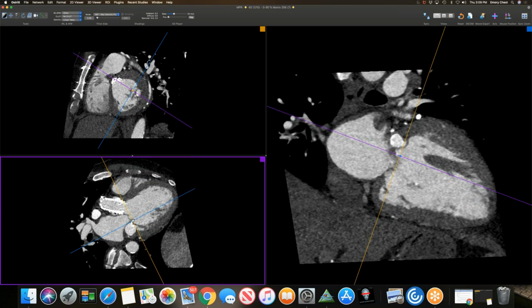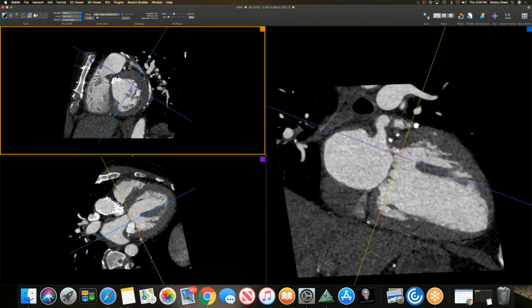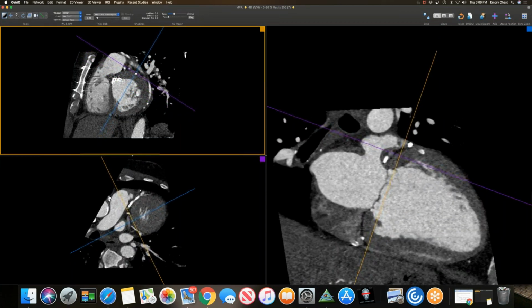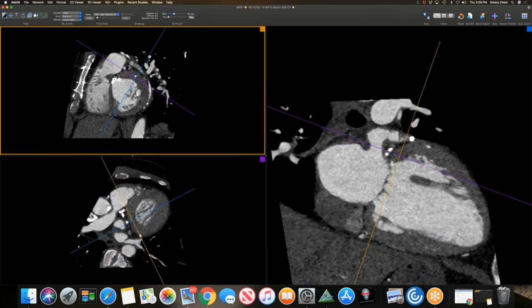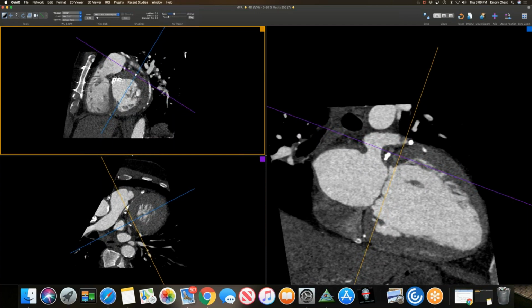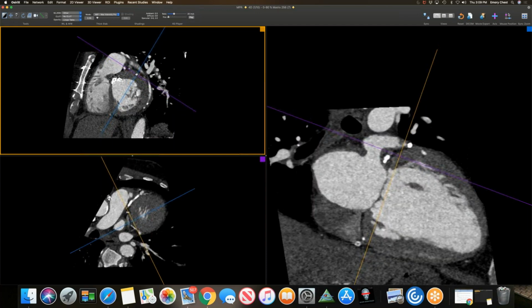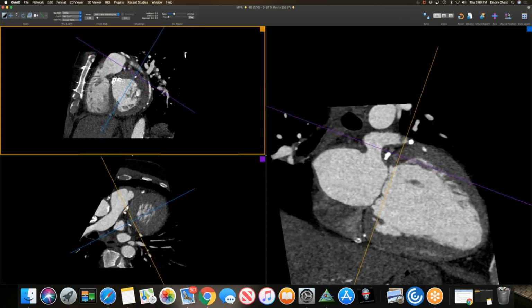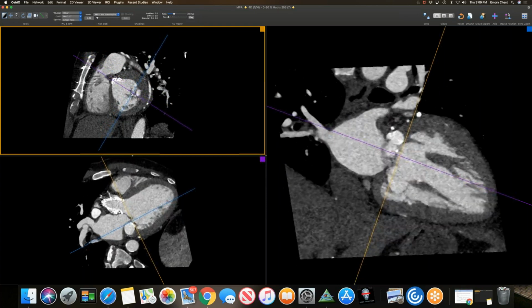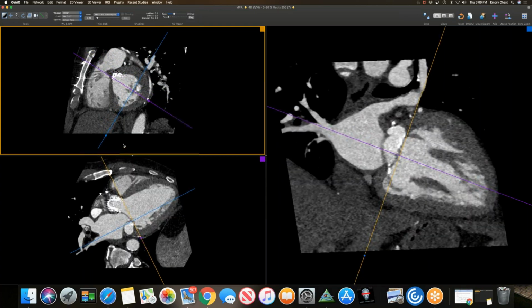And I'm still not sure exactly what caused it. I had two theories. One is that this could be an ischemic infarction. The patient had a history of CABG, so I thought maybe one of his SVG grafts that had been previously stenosed and had to be stented, extending right to that region, supplying that region, became occluded.